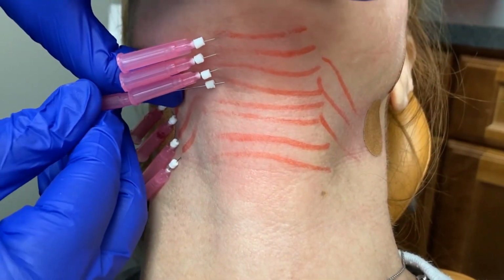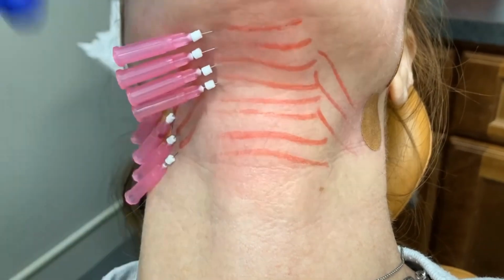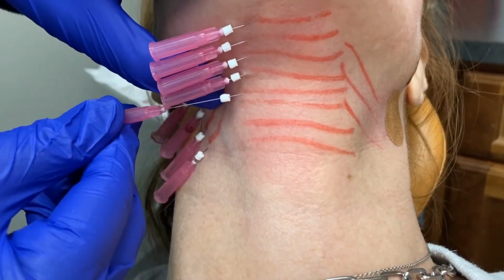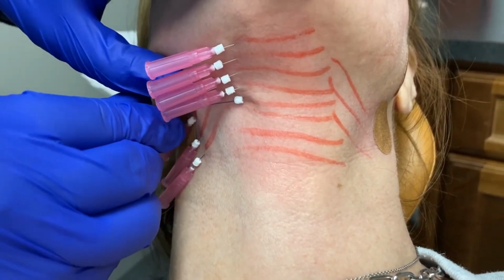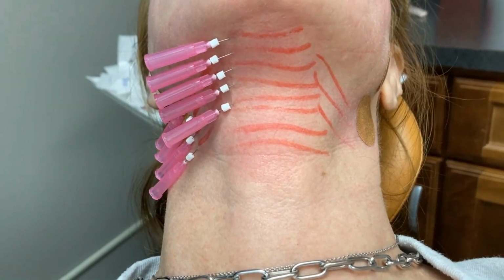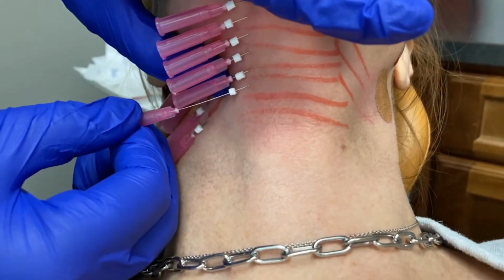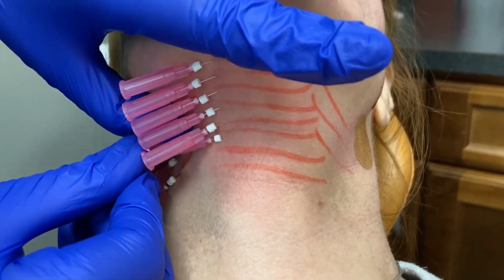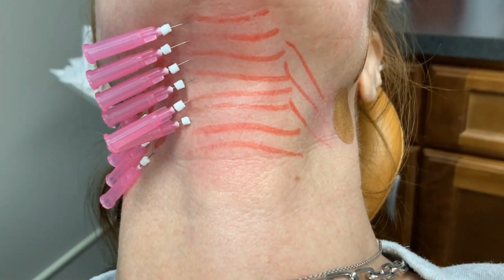Now, why do they go in so easily? Because you've got to be trained. Once you know the right plane for smooth PDO threads, it is so easy to place them. Now, the neck has very thin skin. On her, if you take a look, you can see some Band-Aids, and we just did a 2-vector lift in her face, a 1-vector lift on the jawline, and 3 vectors in the neck. So now, in the same appointment, we're also placing smooth PDO threads in this area.